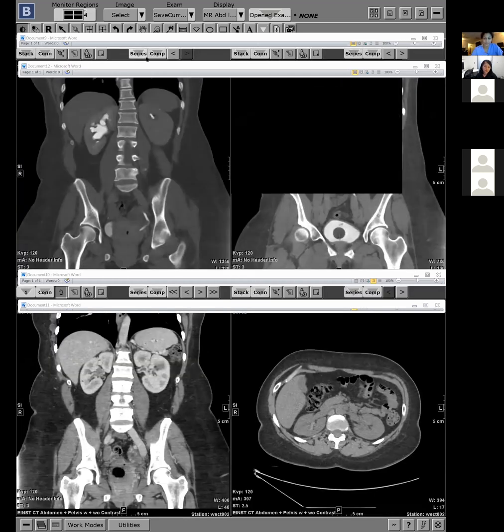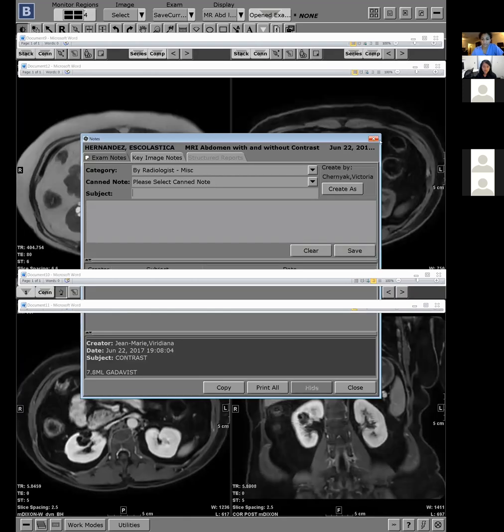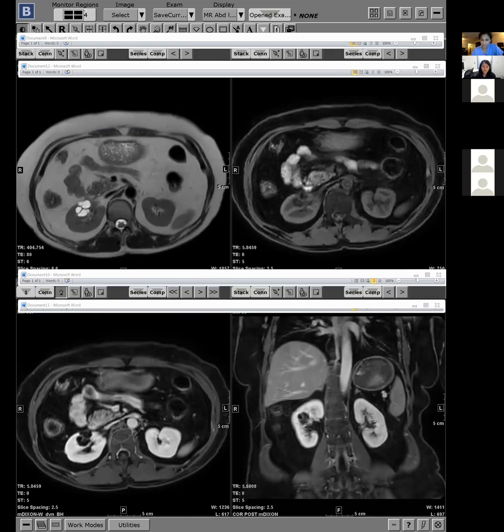And then with the new Bosniak 2019, how do you differentiate a 2 from a 2F? Well, I don't have it in front of me. It's based on the number of septations and thickness of septations. Don't quote me on the exact numbers because I always have to look it up. I'm not on my computer right now, so I can't pull it up. But maybe we can do this as one of the lectures at some point because it is a great update. It's basically the number and or thickness of septations. The greater number goes to 2F, and the greater thickness goes to 2F.